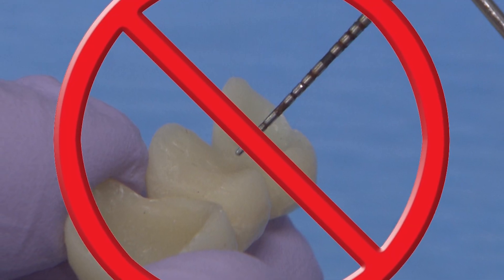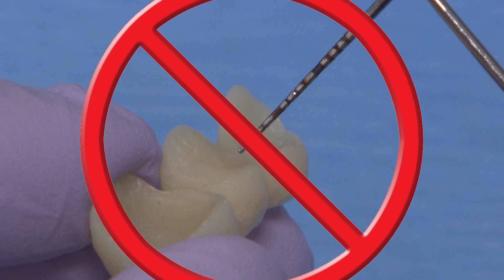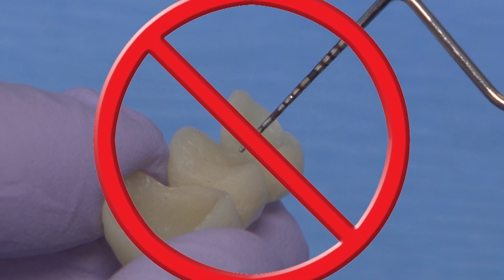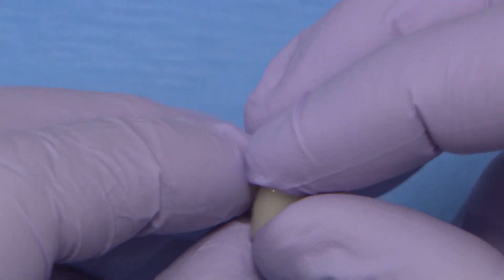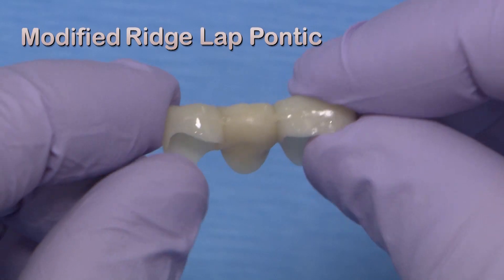In fact, most dentists that I've talked to about this tell me that they absolutely do not use saddle ridge lap pontics in their practice, nor do they even consider them as an option. An option that is more commonly used instead of the full saddle ridge lap pontic design is what is known as a modified ridge lap.